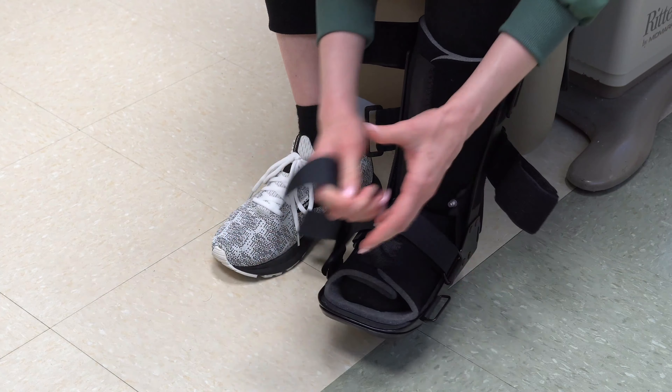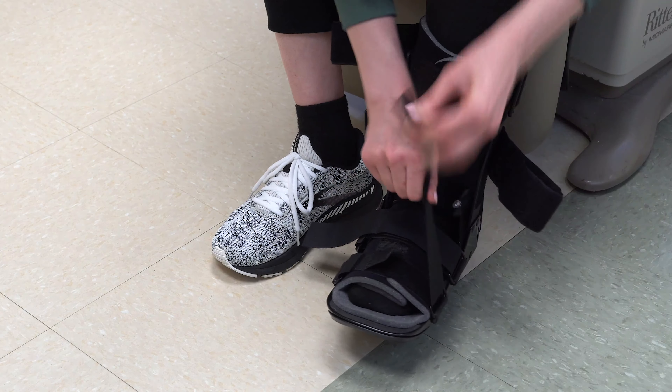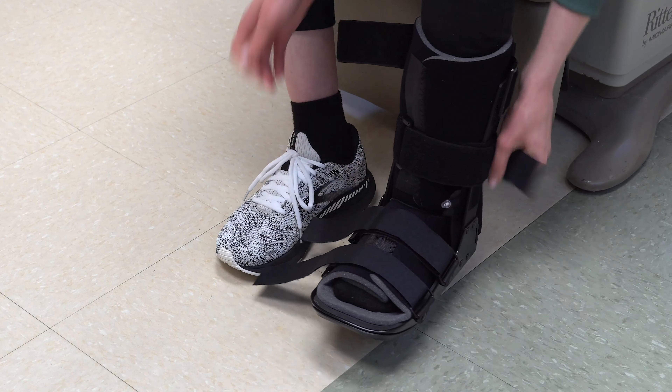After you've strapped those in place, there are four additional velcro straps. Two go over the top of your foot and the other two go over your shin.